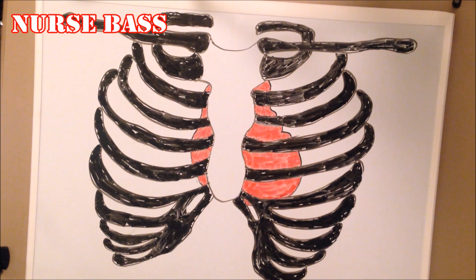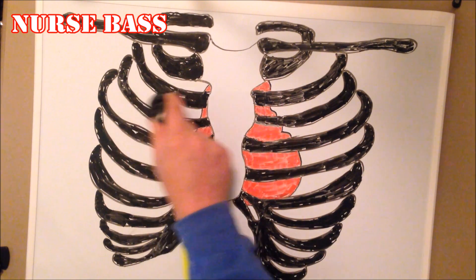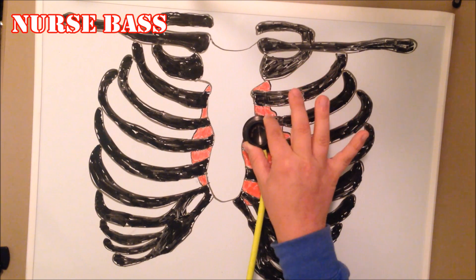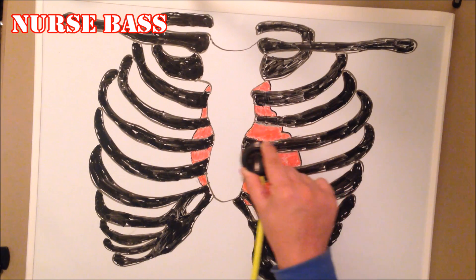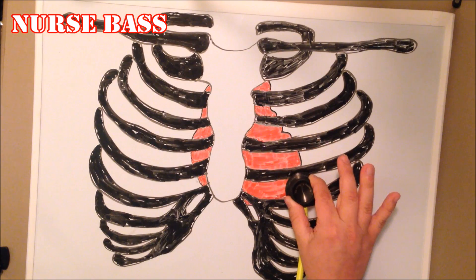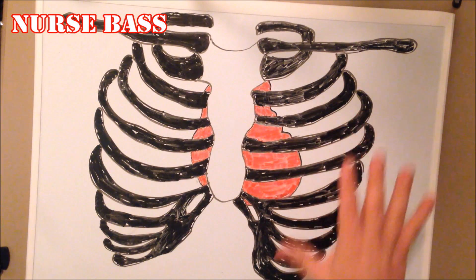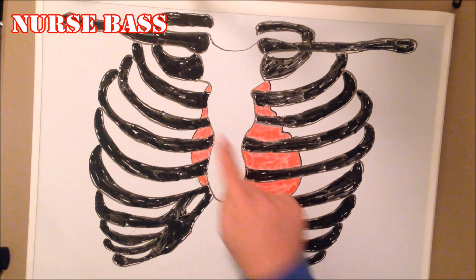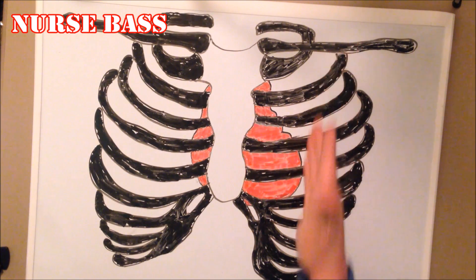Let's go through it one more time: Aortic — right sternal border, second intercostal space. Pulmonic — left sternal border, second intercostal space. Erb's — left sternal border, third intercostal space. Tricuspid — left sternal border, fourth intercostal space. Mitral — mid-clavicular line, fifth intercostal space. The simple way to remember: from Aortic, go over to Pulmonic, go down to Erb's, go down to Tricuspid, then over for Mitral.